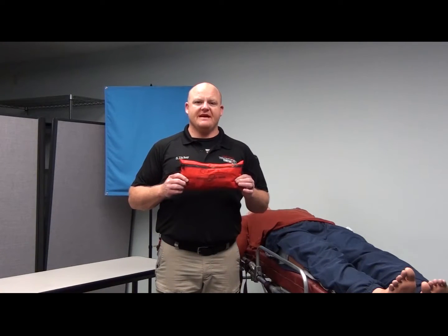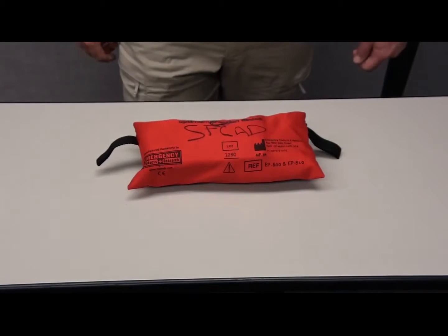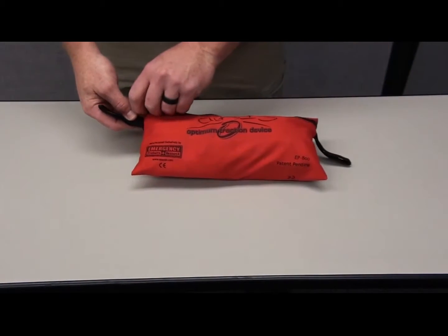This video will cover the Optimum traction device that we use here at St. Francis County Ambulance District. First, let's go over its parts. Alright, so this is our traction splint here that we use.